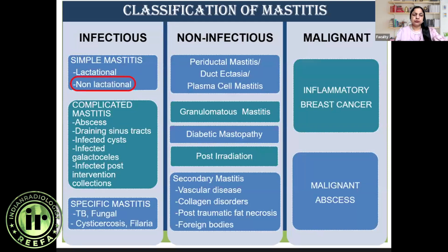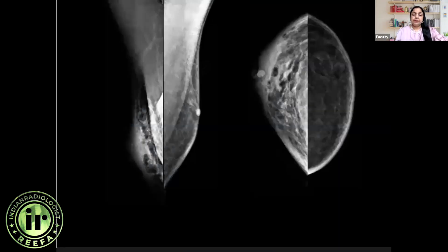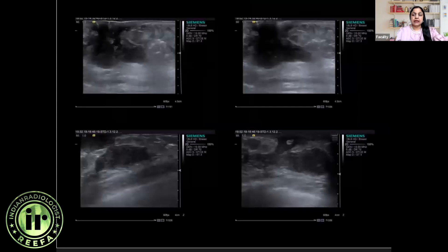Moving to the second subgroup under simple mastitis — non-lactational mastitis. I have purposefully taken this example from a male patient to highlight that yes, even males can develop mastitis. This was a 48-year-old diabetic male who presented with diffuse swelling of the right breast. Mammogram showed diffuse increase in breast density with increased interstitial and trabecular markings, and ultrasound revealed a heteroechoic collection containing internal echoes and debris.